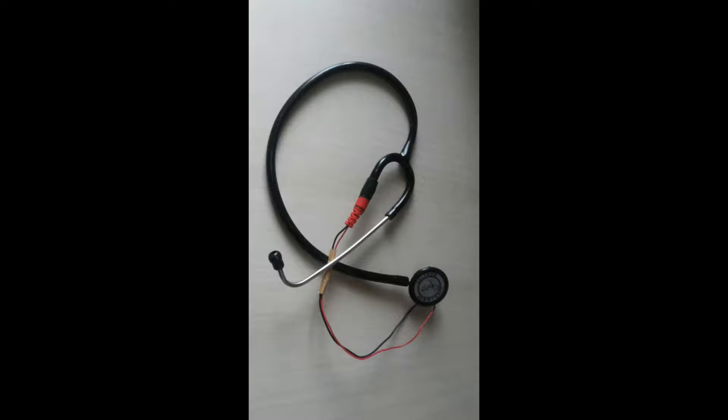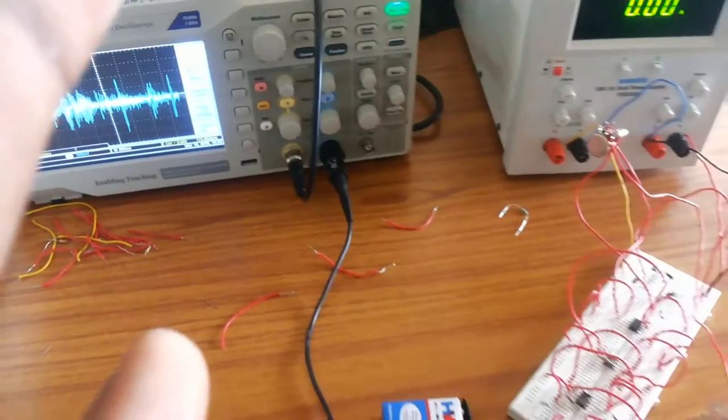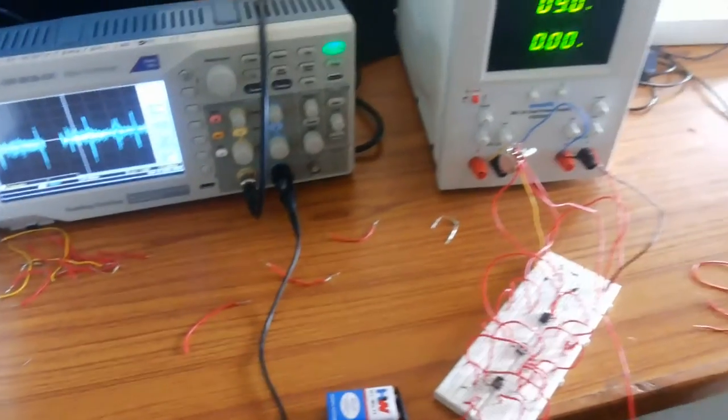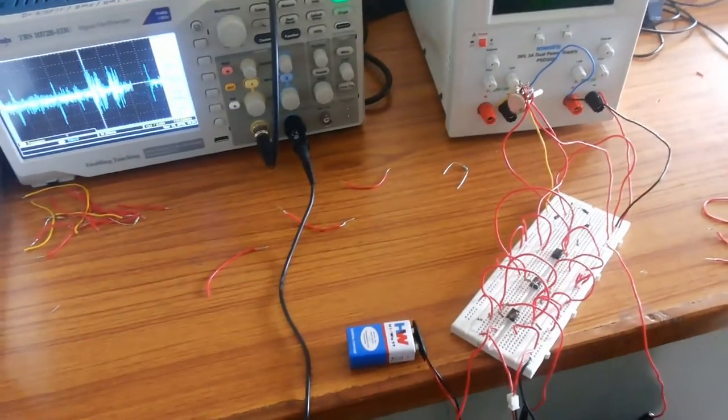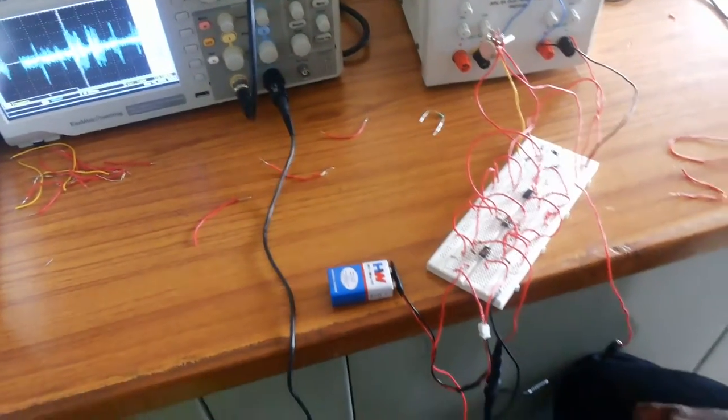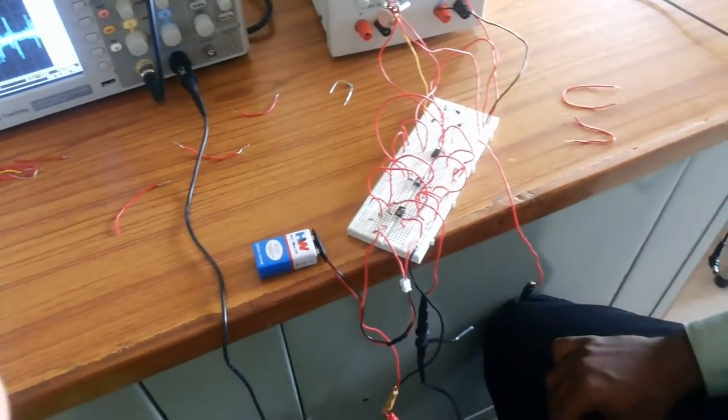Hi friends, we are going to set up an intelligent stethoscope which replaced an intelligent human being. Here I am explaining you the hardware setup.